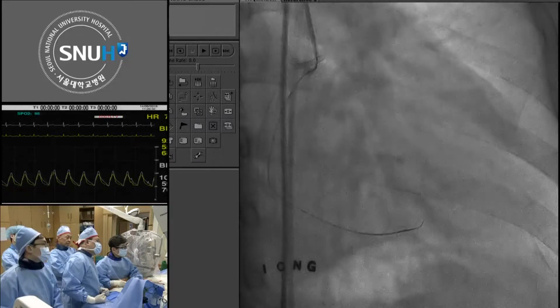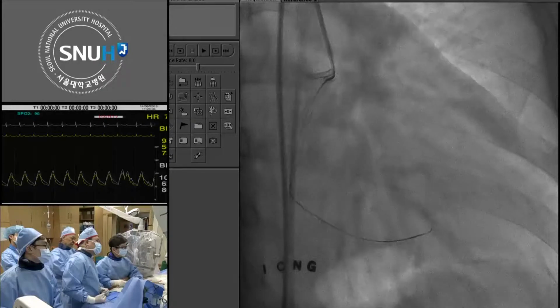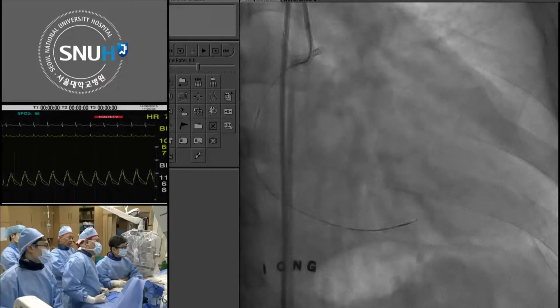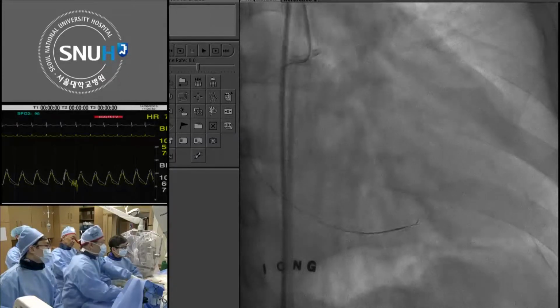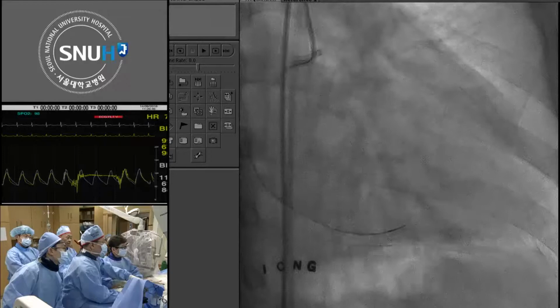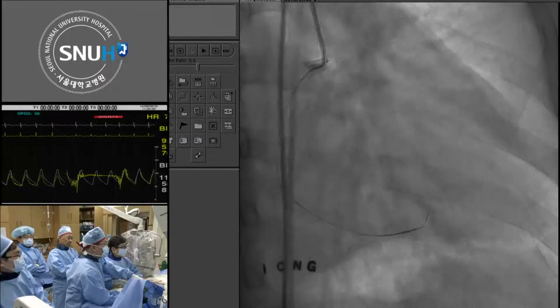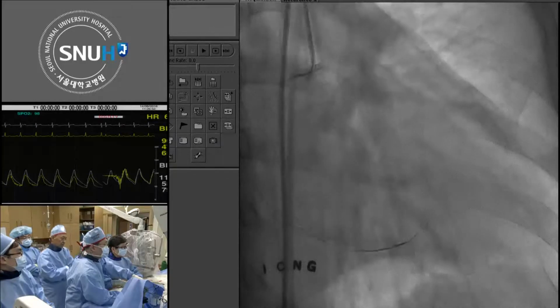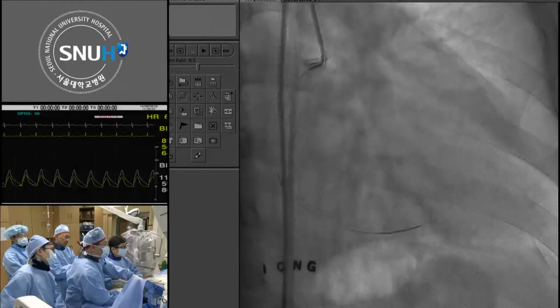Like, look, the point is that... okay, that's good. Test it. Retrograde. He brought a special guest for retrograde. Not good? Still, yeah. Very tough case.